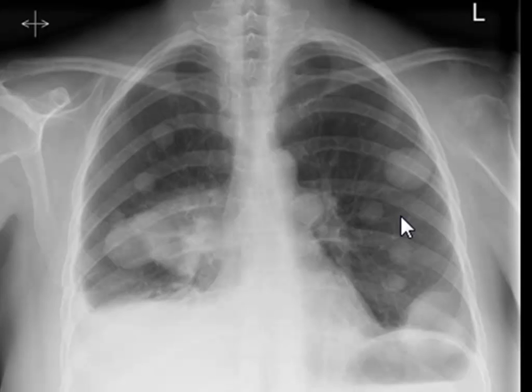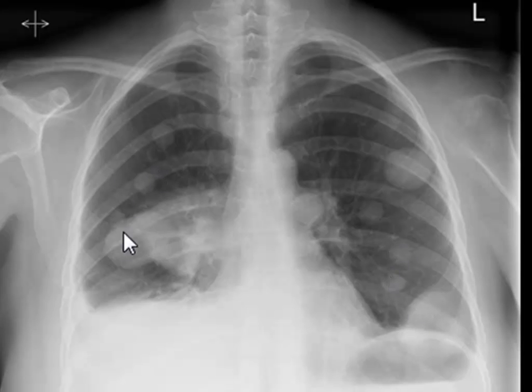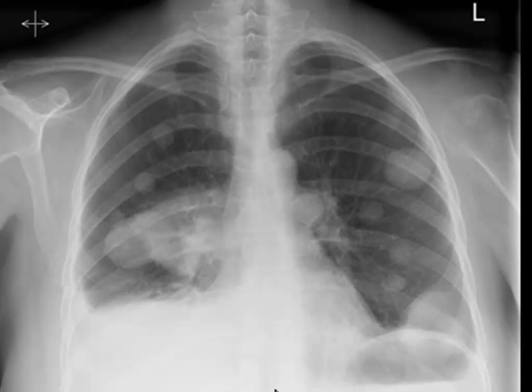Looking at this chest X-ray, we can see multiple round opacities in both lungs. The opacities have sharp margins and clear boundaries, and they are of varying sizes - some are big and some are small. There are no cavitations within the opacities; as you can see, there is no air within any of these lesions.